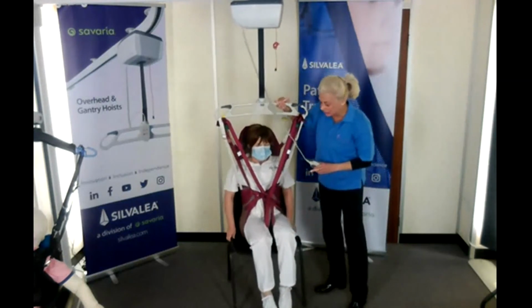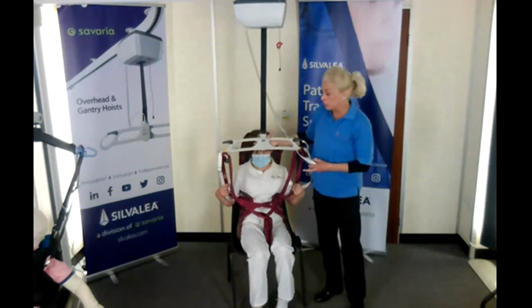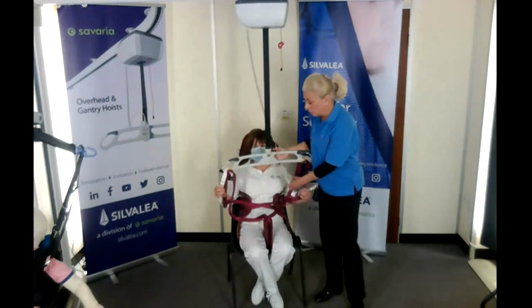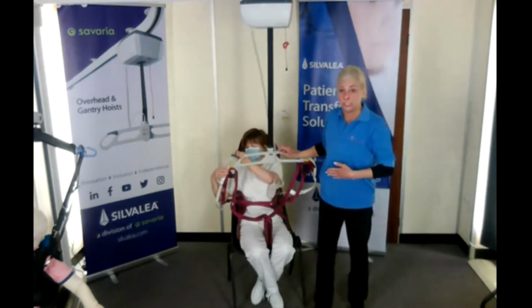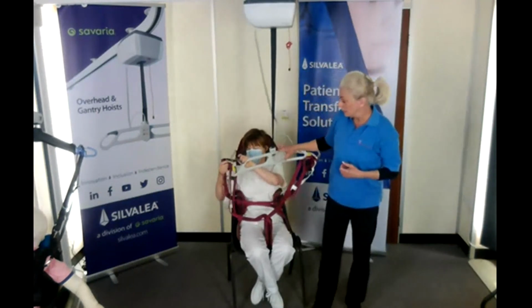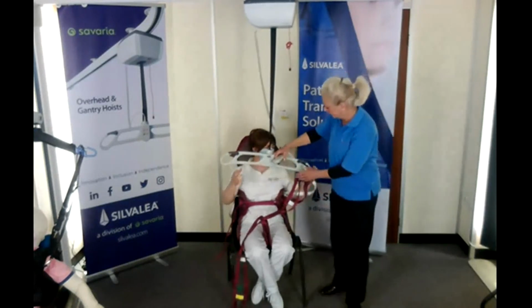It ranges in size. We go down to extra small. I think we could probably even go smaller to extra large. However, when you get larger, you need to think about the proportions of the body, so that if someone is, as I said, shapely, then be mindful that it will fit snug.